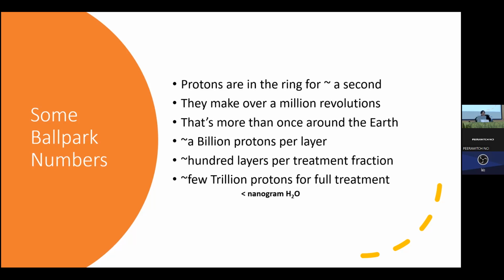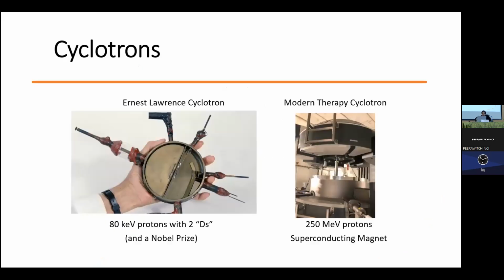I put this up there because when we were treating with protons, both when I was at St. Jude and then at Mayo Clinic in Minnesota, before I moved to Mayo Clinic in Florida, where we're building the Carbon Center, patients would ask, what happens to all these protons? You're treating me with proton therapy to kill a cancer. Your cancer is this big. You're killing that cancer. Where do all those protons go? And to be able to explain to them that there's actually not that many protons going in, so when you think about it that way, it's really amazing that you can cure that tumor with that little amount of radiation.